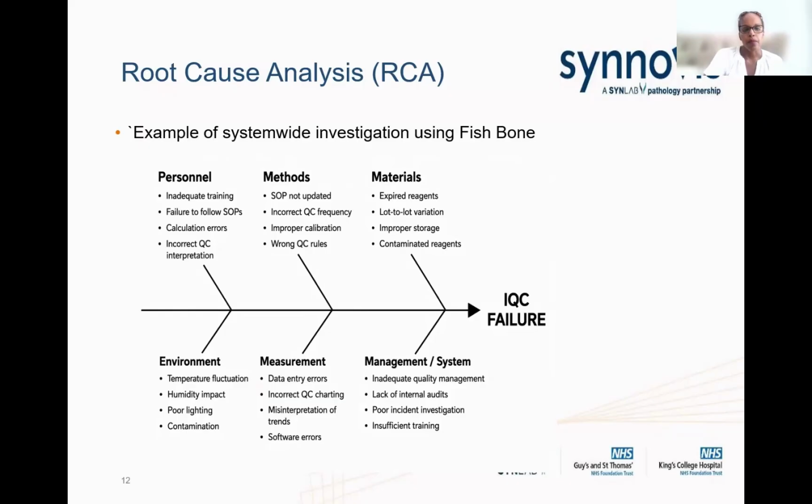So when you're looking at methods, you're looking at, is your process complex? Is your SOP on a risk-based approach? So are your methodology processes risk assessed? Do the staff know what the pitfalls are when they're doing that task? Is it clear and up to date?